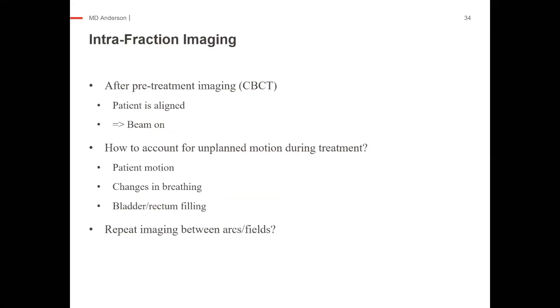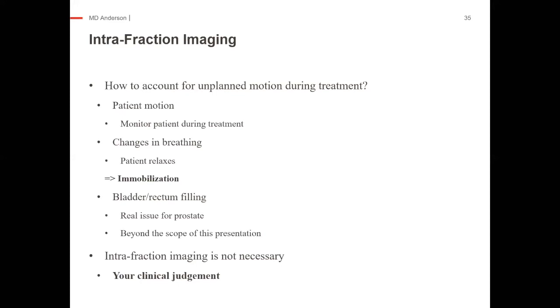So after your pre-treatment imaging is complete, then you want to beam on. But how do you account for unplanned motion during treatment? This is one of these questions that we're still trying to wrap our heads around. If there's any patient motion, changes in breathing, any bladder or rectum filling, are you going to repeat imaging between your arcs or fields? Basically we say, we're going to assume that the patient motion and any changes in breathing, if the patient relaxes, that's going to be taken into account by our immobilization. Any bladder or rectum filling is actually a very big issue for prostate SBRT. But aside from prostate, we don't do any intrafraction imaging at MD Anderson, but this is your clinical judgment. This is where you make that decision.